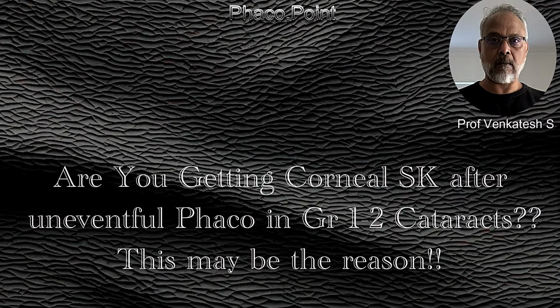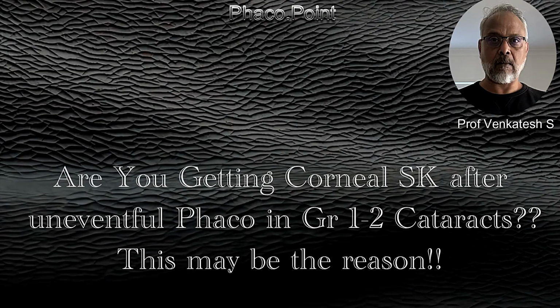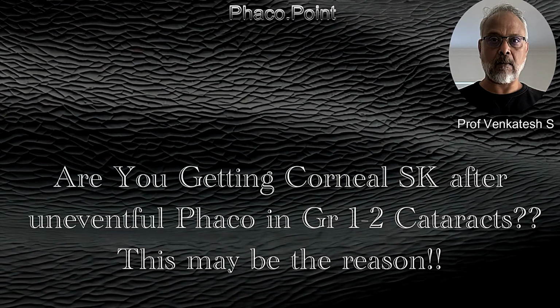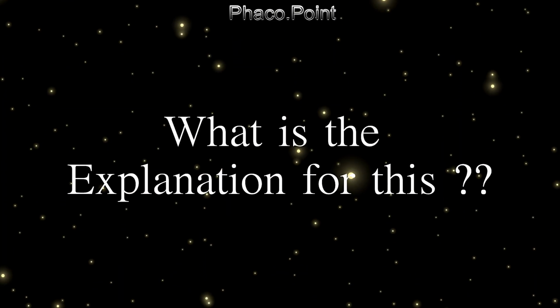Hello friends, do you end up getting postoperative corneal striate keratopathy even after uneventful Phaco and even in grade 1 to 2 nuclear sclerotic cataracts? Now there is possibly an explanation for this, and let's take a look at two surgical clips.